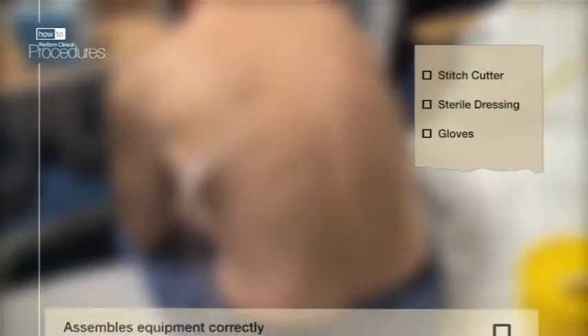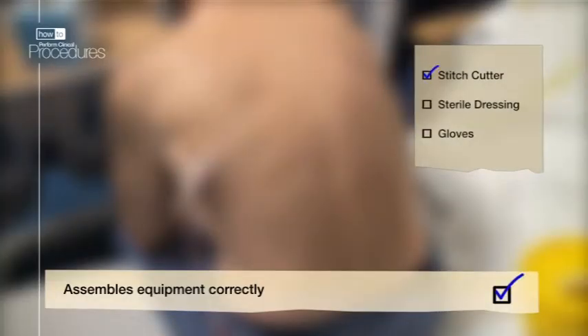The equipment you will need includes a stitch cutter, sterile dressing, and some gloves.